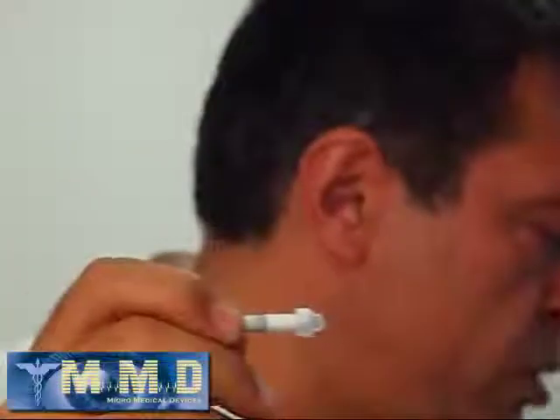The other thing I do to make sure that the patient is fixating properly, if you noticed earlier, I ask the patient to look at the blinking light, and I move the probe back and forth and make sure that the patient is following the probe properly. That way I know that they're looking directly at the blinking light as I approach the cornea. And your approach should be very gentle, just so that meniscus and the eye couple together, and you should have very good immersion captures with high accuracy.